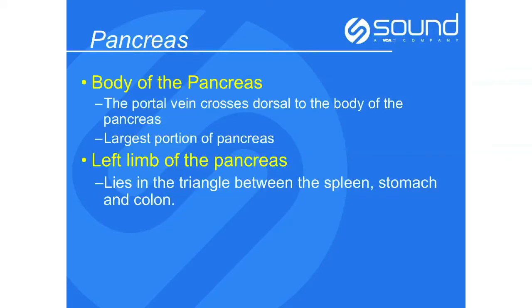When looking at the pancreas, the biggest thing to realize is that it's largest at the body of the pancreas. The body is sandwiched right at the pylorus and follows along the greater curvature of the stomach — that's the thickest portion you can see. On ultrasound, we position as far cranial in the abdomen as possible, just caudal to the liver at the level of the pylorus. In cats, the left limb of the pancreas is what we generally identify, as it lies along the greater curvature of the stomach between the spleen laterally, and is caudal to the stomach and cranial to the transverse colon.